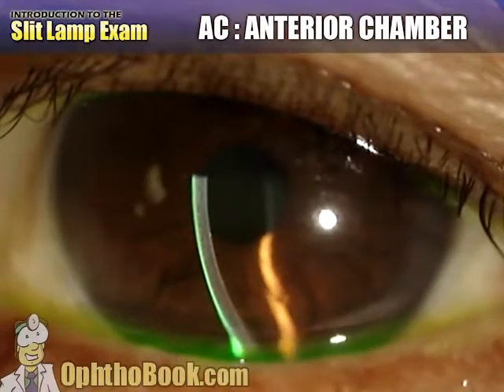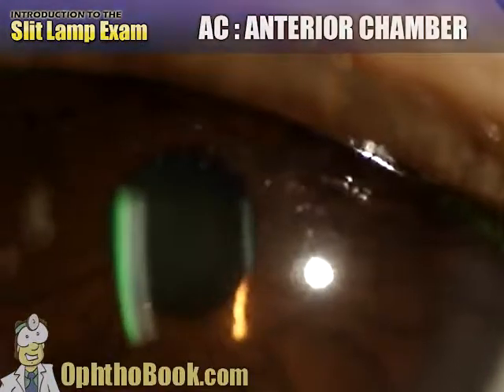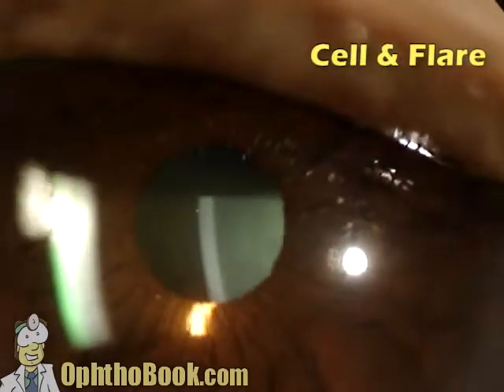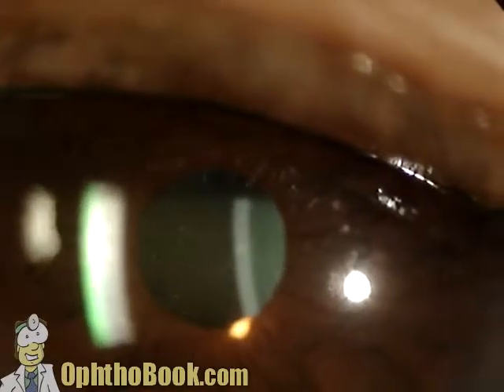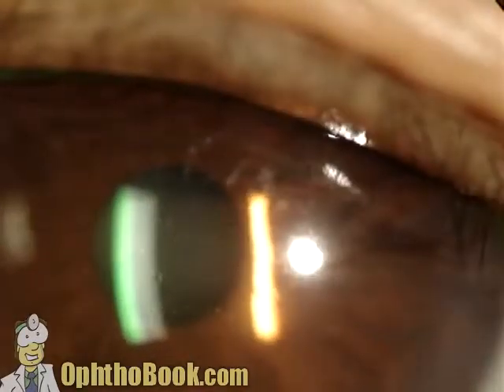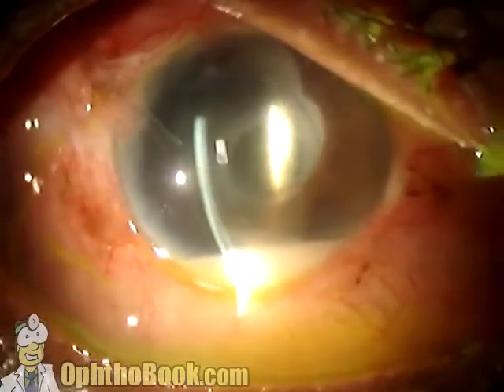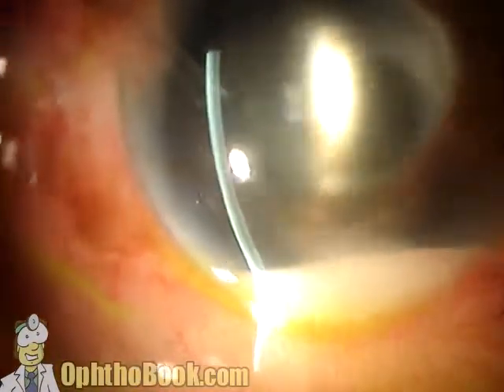This is the anterior chamber. Make your light beam shorter, a little bit thicker, and turn the intensity as bright as you can — you'll see cell and flare. Cell are individual cells floating in that potential space. Flare is that foggy appearance from protein released by inflamed blood vessels — the brighter the light the easier it is to see, and using the pupil as a background makes it easier. This is more flare, less cell. If you get enough inflammatory cells, they settle to the bottom and form that hypopion we looked at before.